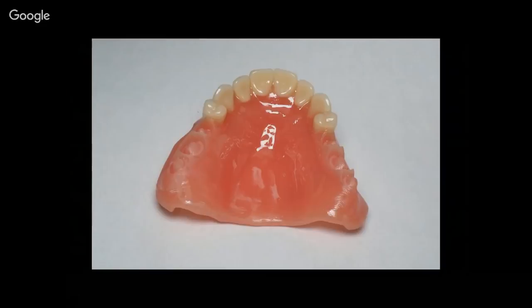And then what I actually use to bond in the teeth is I will just take some of that 3D printed base material still in its wet form, the unprinted form. I put some on a paintbrush and I fill up each of those wells into which the teeth go. I dab it into the little retention holes that I make on the underside of the teeth, and then I push it into the socket and squeeze them together. And then I just hit that with my light curing unit, like the kind you would use for a filling, and that will more or less tack it into place.